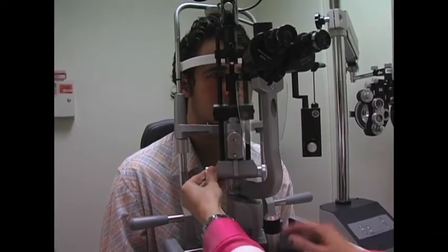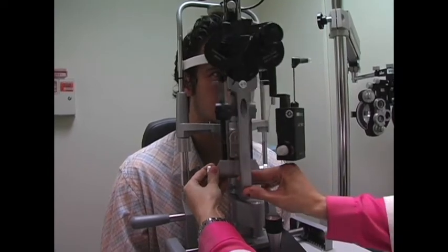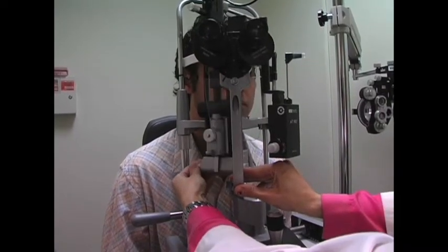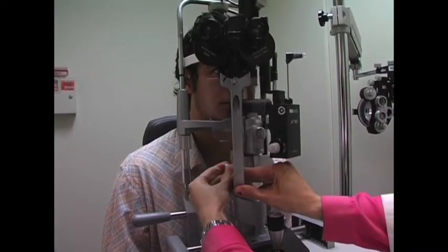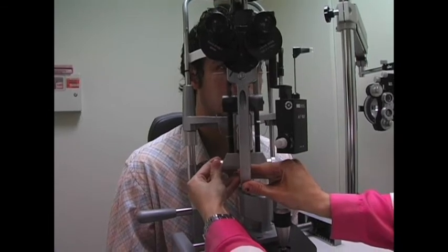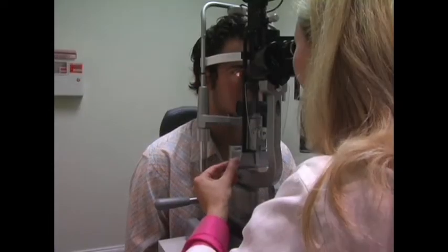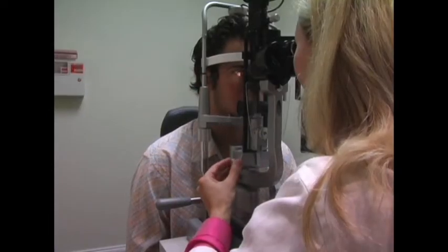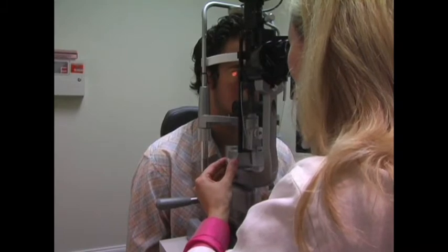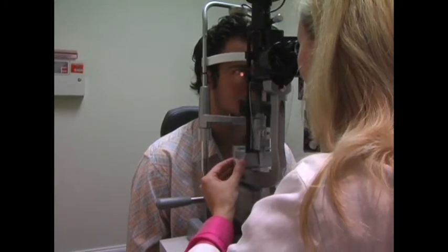However, there are times when you may need to set the microscope arm at an angle to better view certain pathology or to make it easier to access the eye during foreign body removal. Once you and your patient are comfortably and properly positioned at the slit lamp and the overhead lights are dimmed, you are ready to begin.